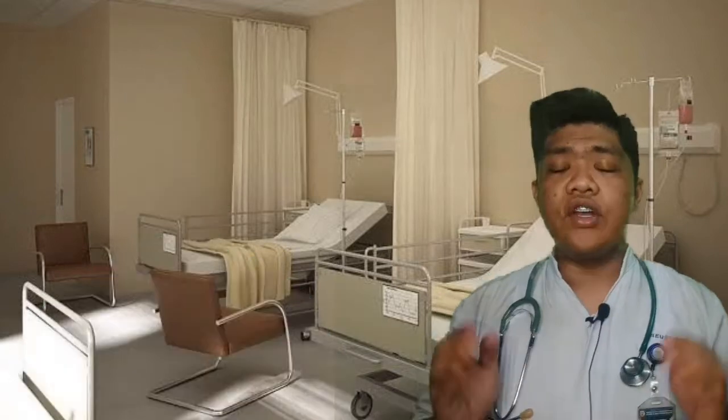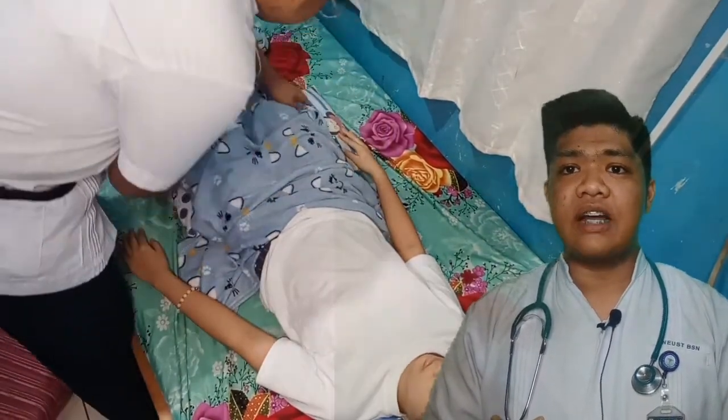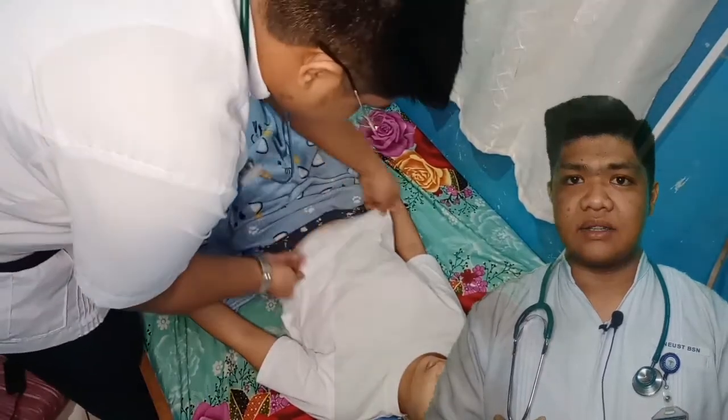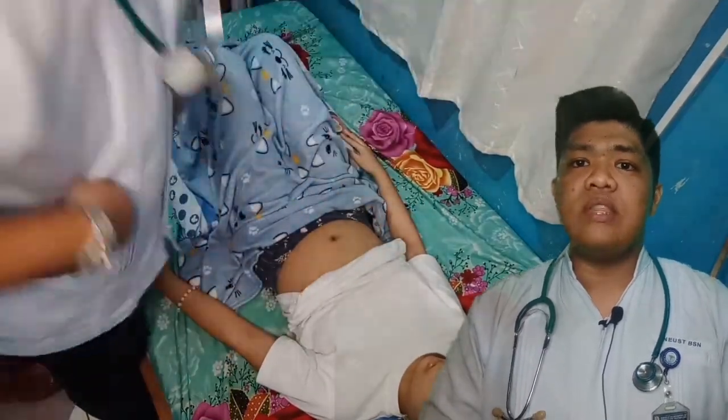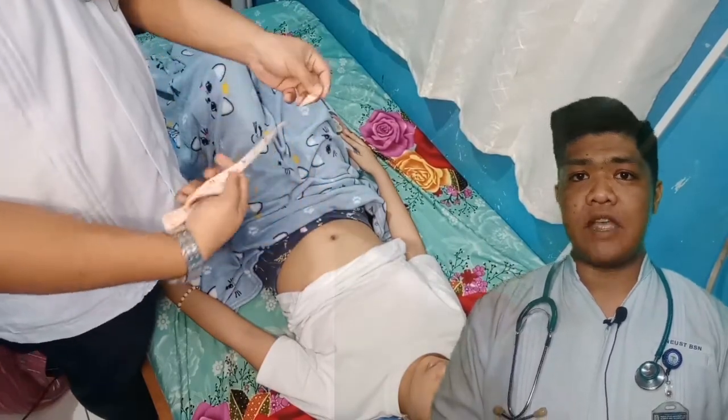Ma'am, today we will be having a fundal height measurement. It will not hurt you as well as your baby, and it will only take a short period of time. Is it okay for you, ma'am? For the first step, we need to position our client in a dorsal recumbent position and instruct our client to relax. Next, we need to expose the womb of the mother and get the tape measure.